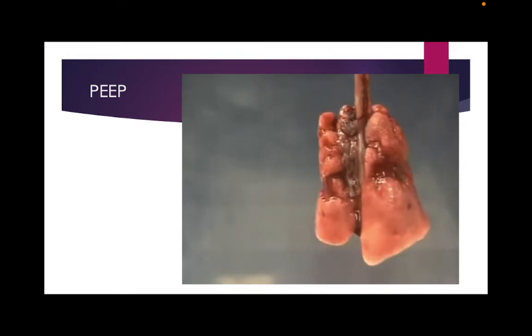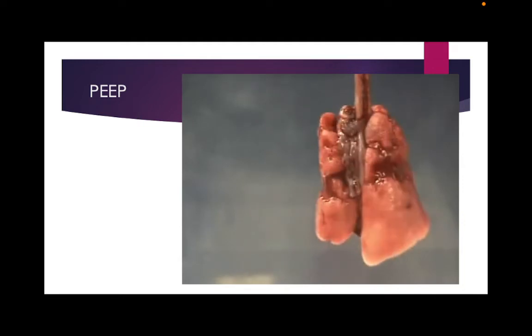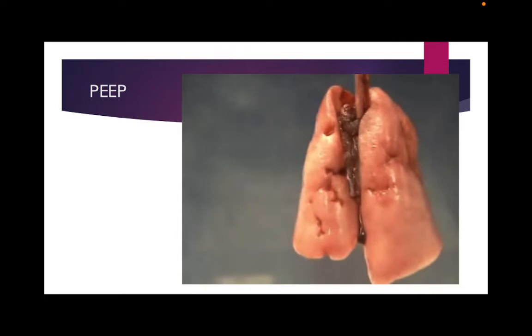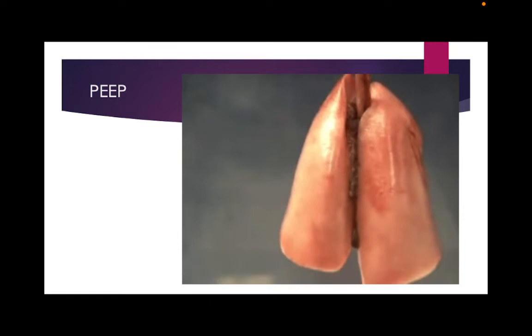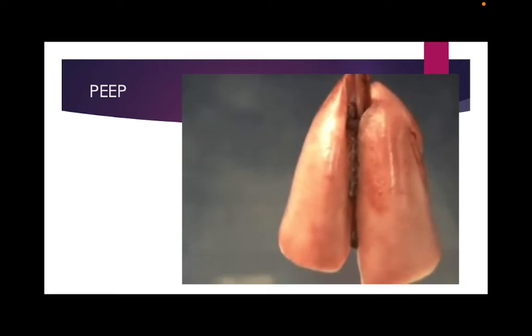It doesn't tell you pressure, but it's taking a lot. We're inflating during inhalation, and then we're collapsing. And then we're inflating, and then we're collapsing. And so we're taking this lung, and we're pulling it apart. We call that shearing forces, okay? So you're actually causing damage by letting the lung collapse. Once the lung is inflated, it doesn't need as much pressure to inflate every time. So barotrauma is not actually a problem with PEEP.